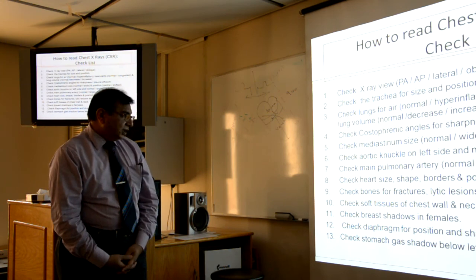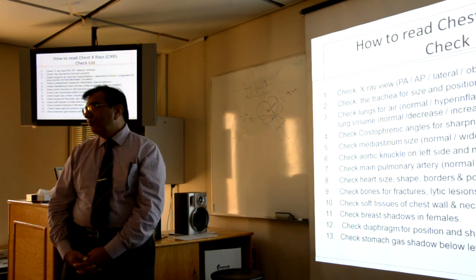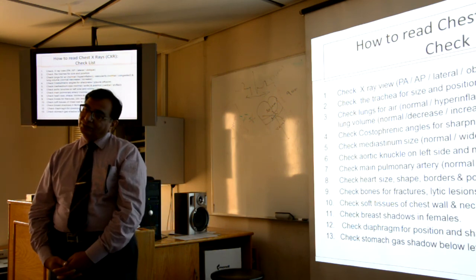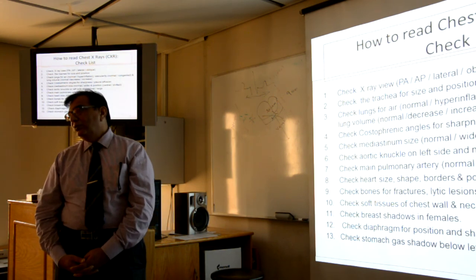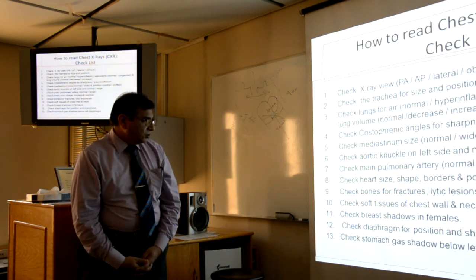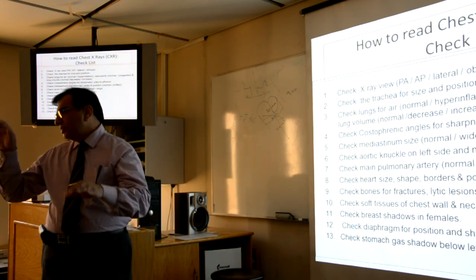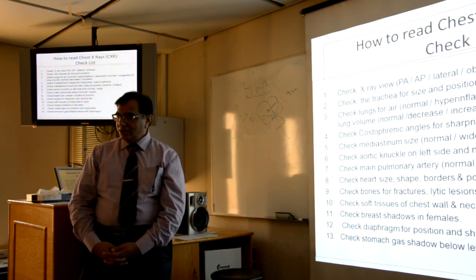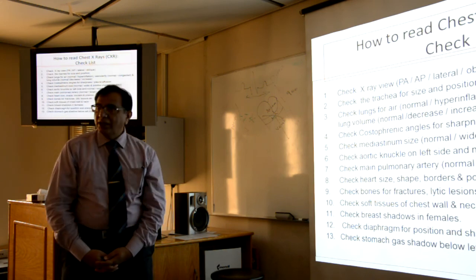Okay. Check the positions of the diaphragm. The right is slightly higher than the left. Left is slightly lower down, due to the weight of the heart. But the discrepancy in the position should not be beyond 1.5 centimeters. Otherwise, it suggests some abnormality.